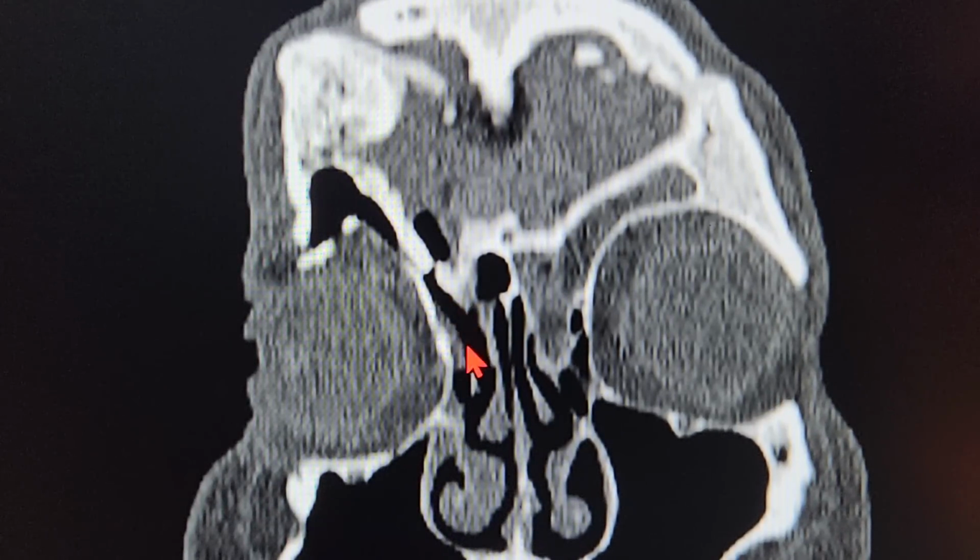This is the frontal recess here. You can see right there. That's the frontal recess, the most posterior aspect of the frontal recess. Now I'll cross check this. I'll show you in the surgical video part as well. See this segment over here, that's the posterior wall of the frontal sinus. That is basically just this bone, the posterior wall of the frontal sinus.